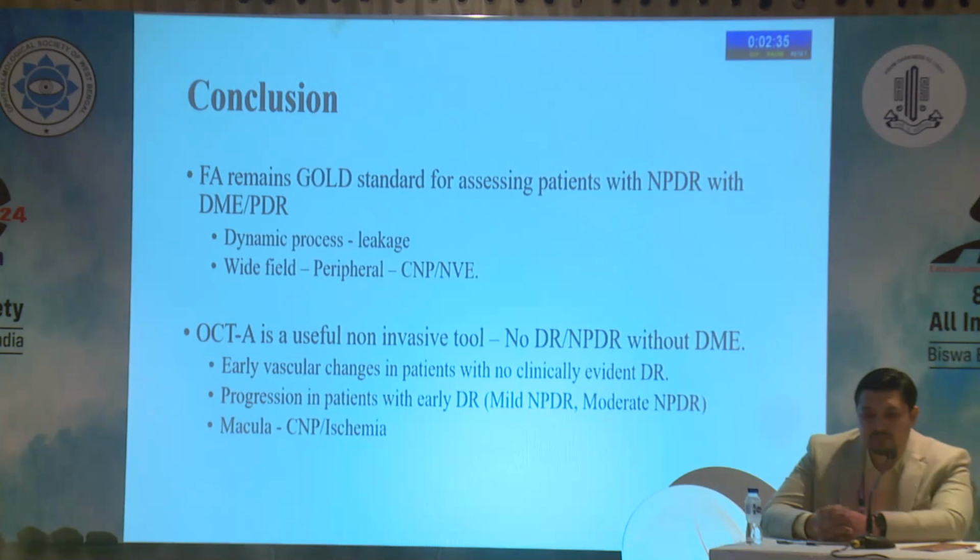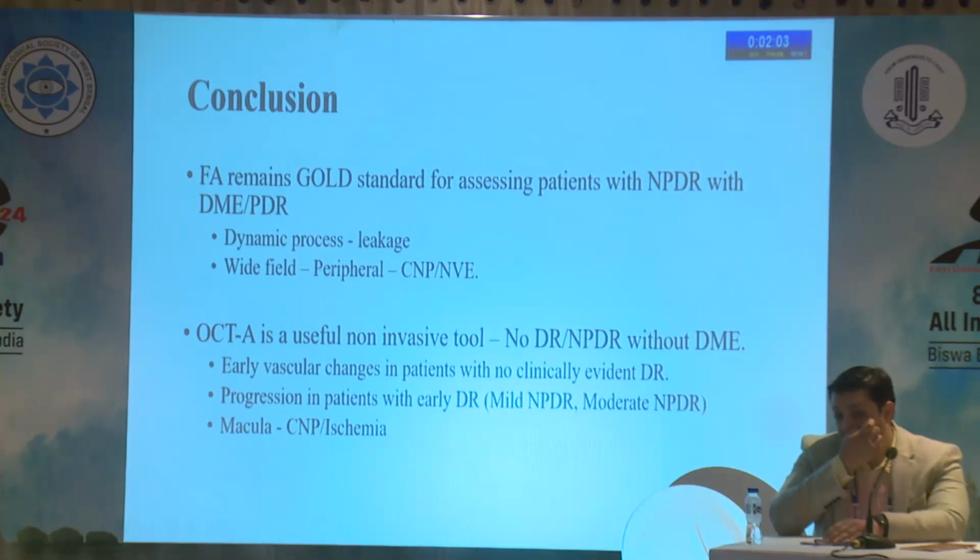But in my opinion, especially in today's scenario, if you give me a choice, I would still like to go ahead and do ultra wide field FFA. If I just have a normal FFA, conventional FA, I would probably go ahead with OCTA and not do conventional FA. But the amount of knowledge that ultra wide field FA provides is not currently provided by the currently available OCTA machines. So another advantage of FA is that it is a dynamic process.